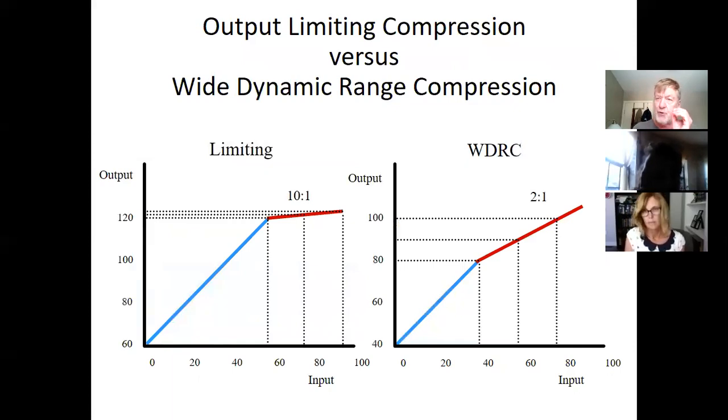Once again, though, note the salient features. Output limiting, high knee point, and in English, this just means that it waits to go into compression until the inputs have increased to some degree. And then when it goes into compression, it really goes into compression. And as the inputs may increase by whatever dB, the outputs barely increase at all.